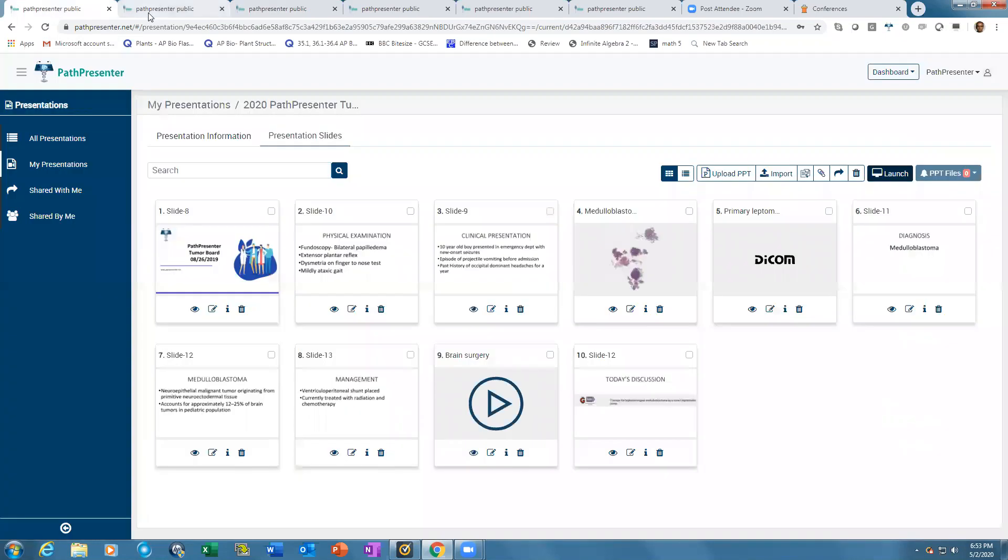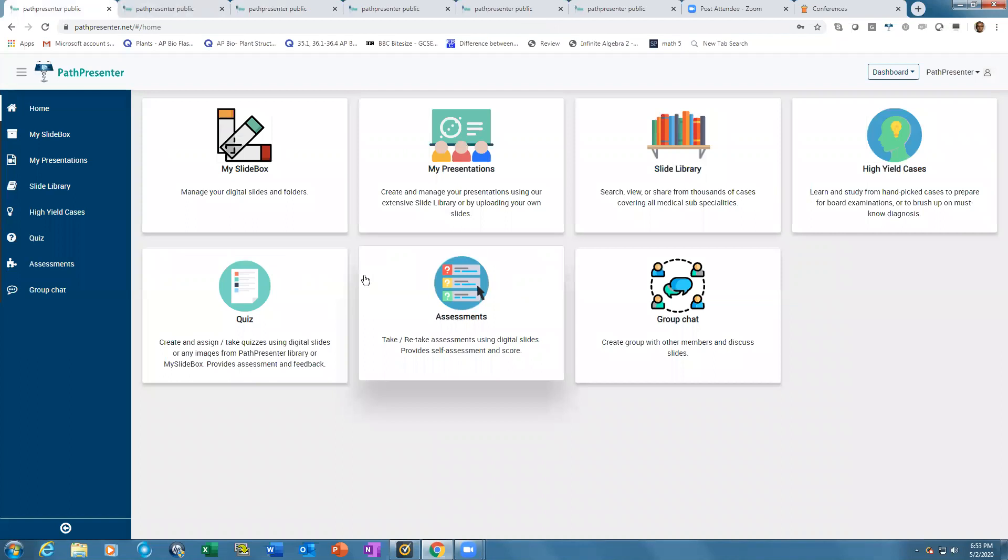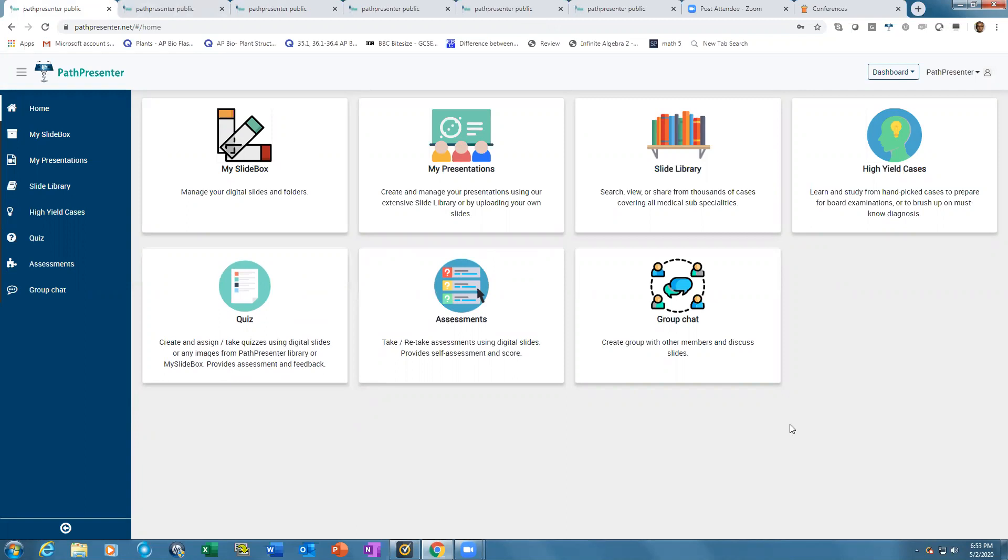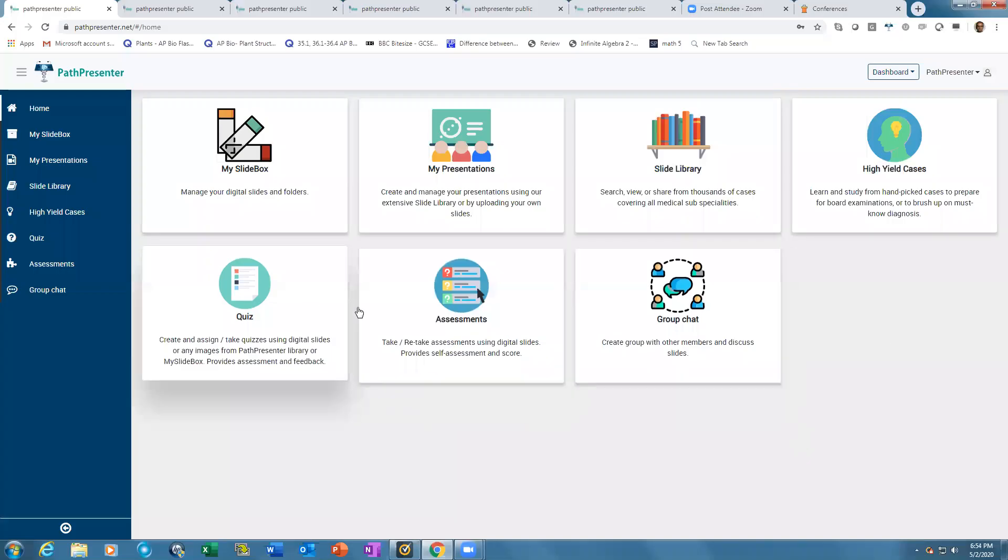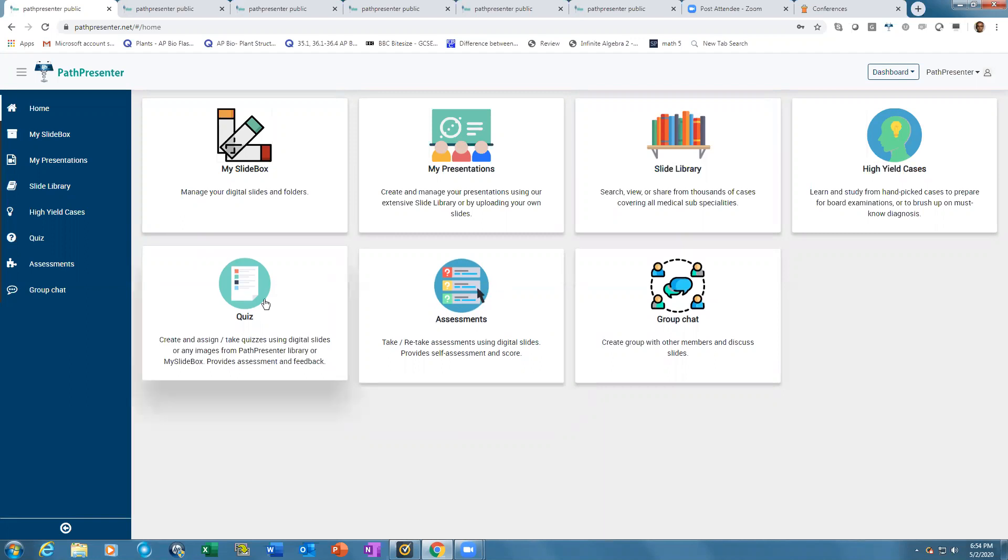The quizzes and self-assessment allow you to create testing modules for students that can be easily shared with trainees. Self-assessment allows users to see answers immediately after finishing, while in the quiz they must finish first before it goes back to faculty who provide an assessment.